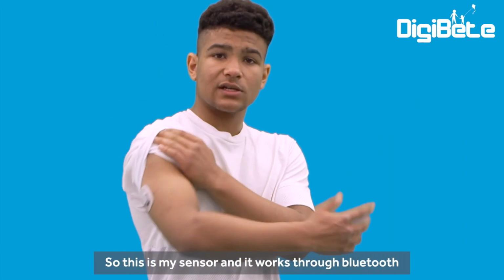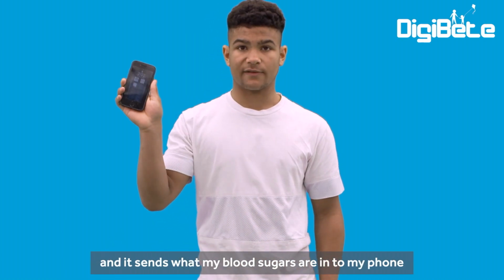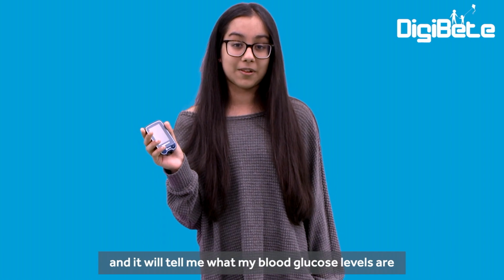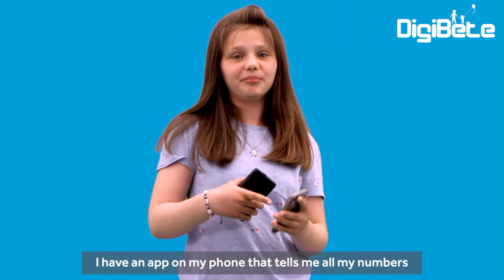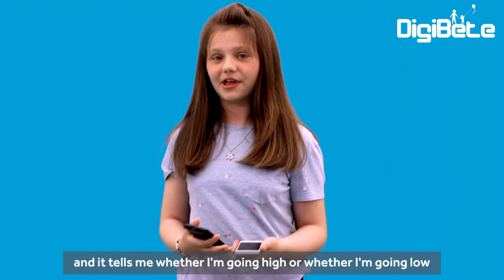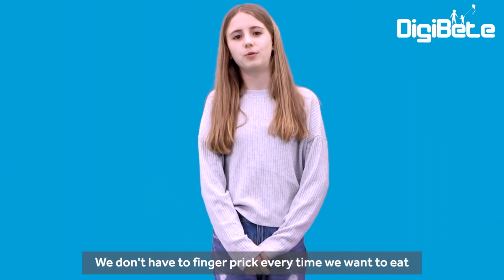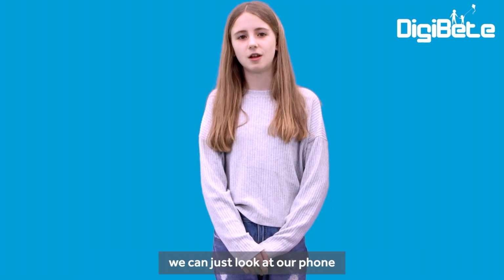So this is my sensor and it works through Bluetooth and it sends what my blood sugars are into my phone. I use the Libre to test my blood glucose levels. I have a sensor on my arm and I scan it with this and it will tell me what my blood glucose levels are. I have an app on my phone that tells me all my numbers and it tells me whether I'm going high or whether I'm going low. Other people can see what my blood sugars are in real time and they can see what's going on. We don't have to finger prick every time we want to eat. We can just look at our phone.